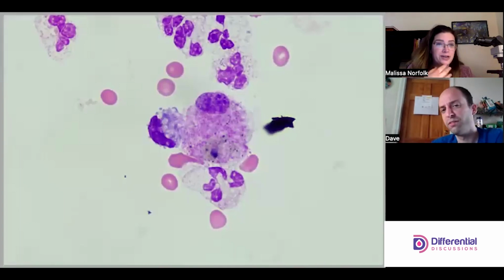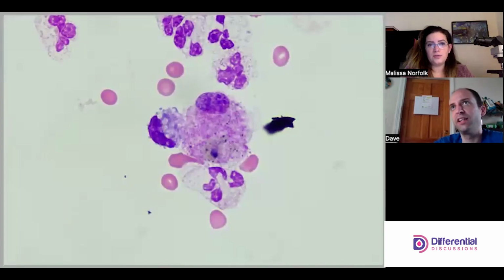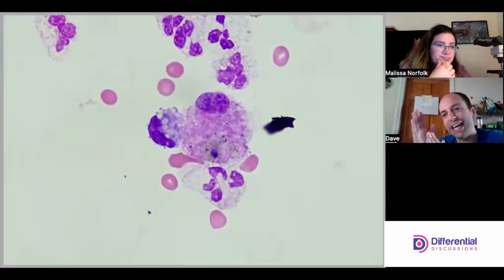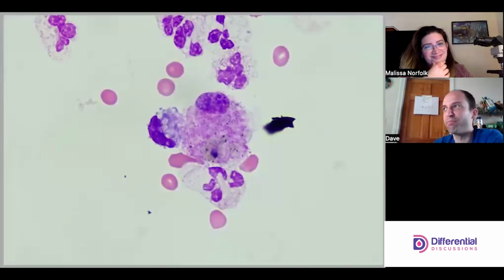Yeah, I agree. I just thought we should point out, devil's advocate, why it's not malignant. We also need to think about how, for a malignant cell to appear in the alveolar space would be a little bit odd. It's not a typical place we'd see malignancy. Lung cancer is usually in the interstitium, inside the tissues, right? So not so much on the outside of the lung.